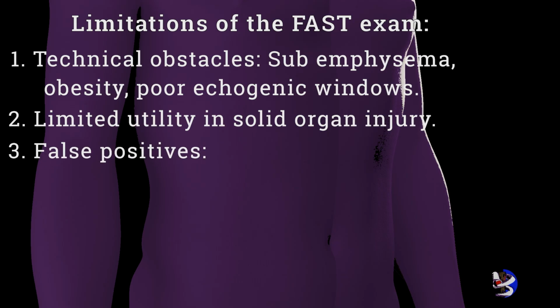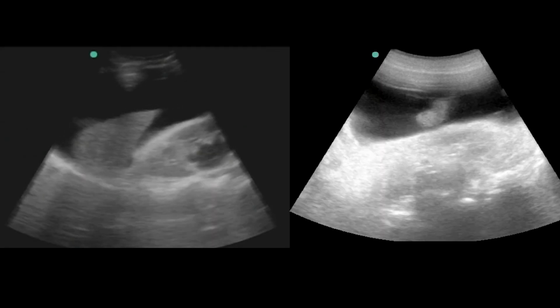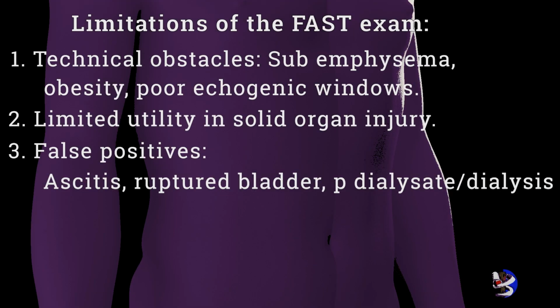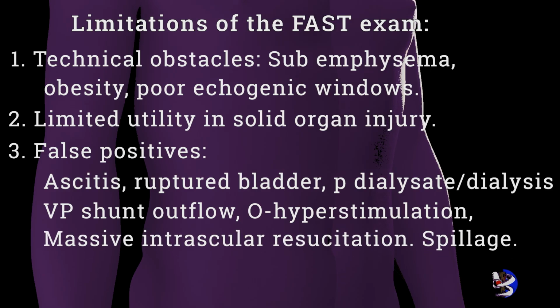False positives. Free fluid does not necessarily imply blood, such is the case in patients with ascites, ruptured bladder or peritoneal dialysis, peritoneal dialysate, VP shunt outflow, ovarian hyperstimulation, and ovarian cyst rupture. Massive intravascular volume resuscitation may result in a false positive FAST exam from the result of movement of fluid from the intravascular to the intraperitoneal space.